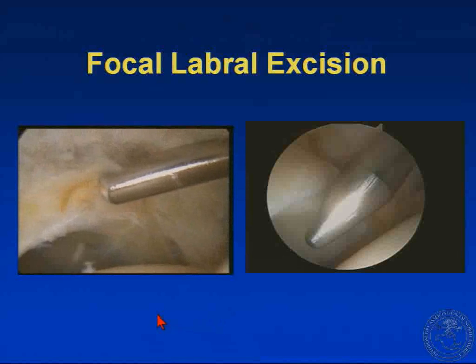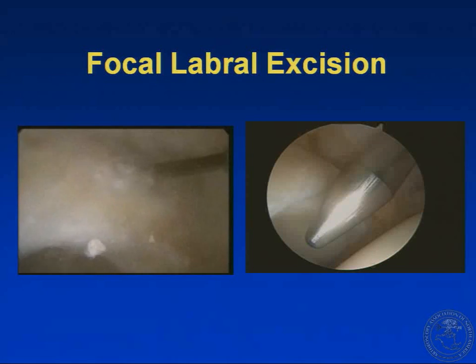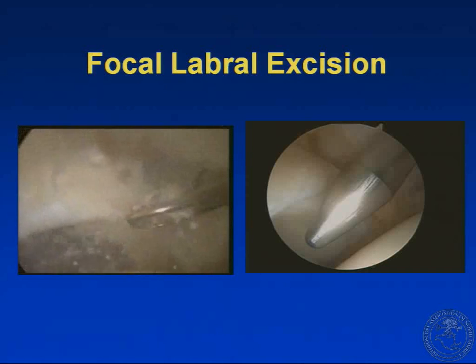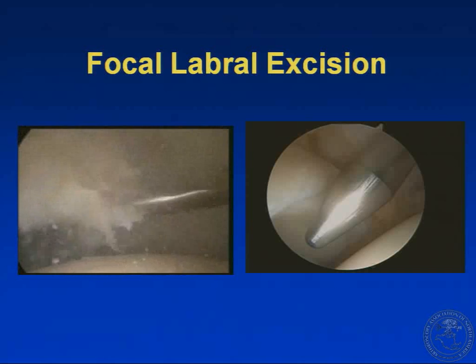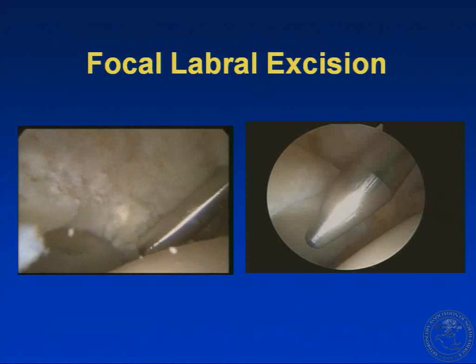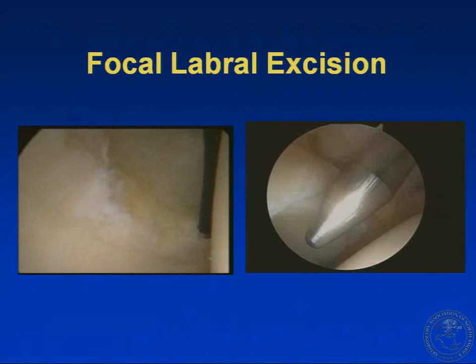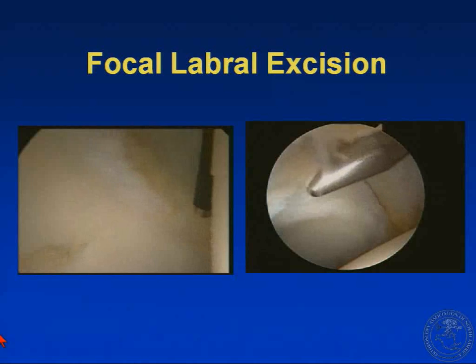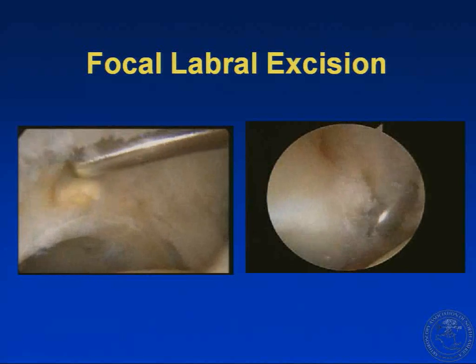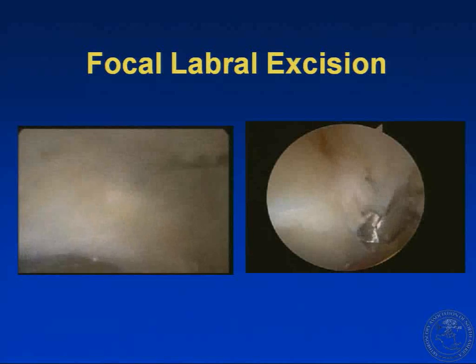The first example shows a calcific deposit within the labrum that initially appeared to be a small area, so with pincer-type impingement we attempted a labral takedown. However, as we progressed through the labrum, more and more calcific deposit — almost like a calcific tendonitis-type deposit — kept emerging. At that point we used a biter to excise the labrum along the region of pincer impingement, then a shaver to excise the remainder prior to rim resection. In the next example, the labrum is fairly normal anterior-superiorly, but anteriorly there is an ossified labrum. In that situation, a burr is used to resect the labrum since there is not much tissue to take down for refixation.